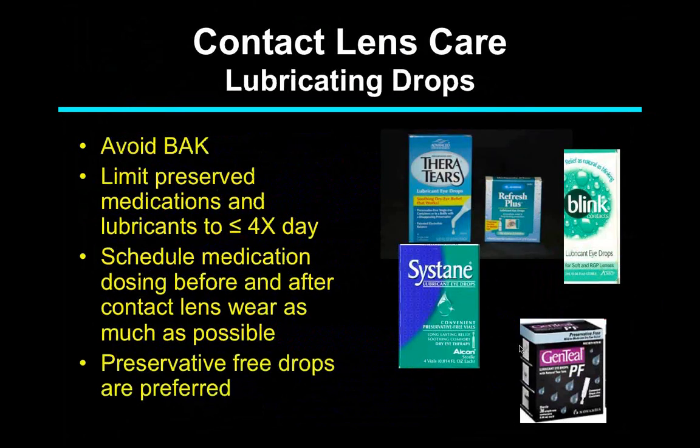For lubricating drops in these patients, your best bet is using preservative-free. We can safely use preservative-free tears over any of the soft contact lenses or rigid contact lenses. Limit preserved medications to less than four. That includes all glaucoma medications, steroids, antibiotics, what have you, because most of them are preserved with benzalkonium chloride. Toxicities are dose-associated events. The more drops, the greater the dose, the greater the damage which may occur.